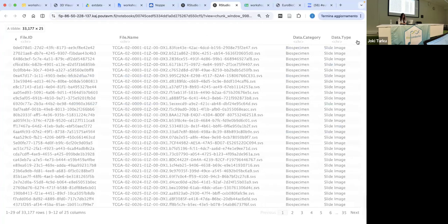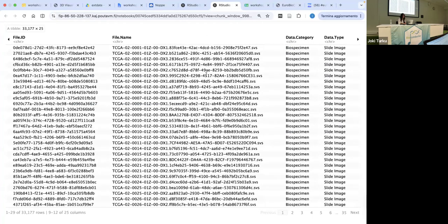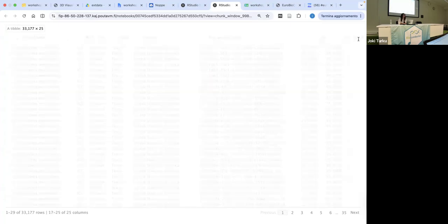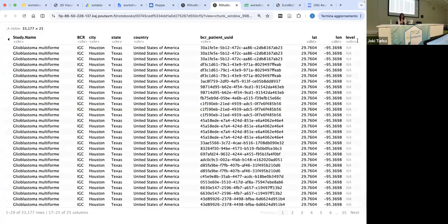And then we have also other information like the complete file name, that has to deal with the curated TCGA packages, so the TCGA data. And then all the same information that you can find in the imageTCGA Shiny app. So the city, the country, also the latitude and longitude, just to make a dot for your country on the map.